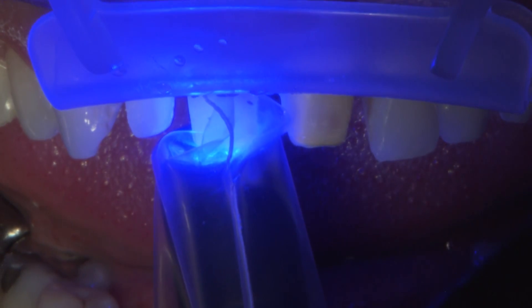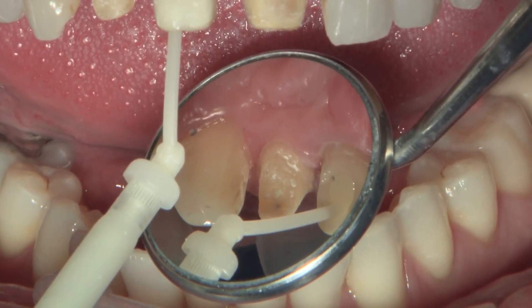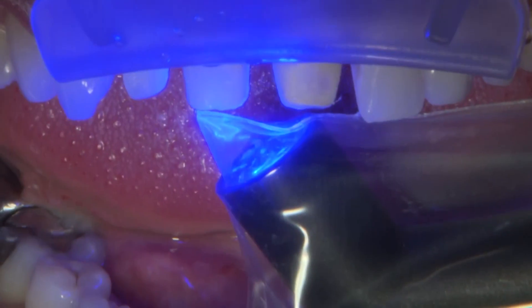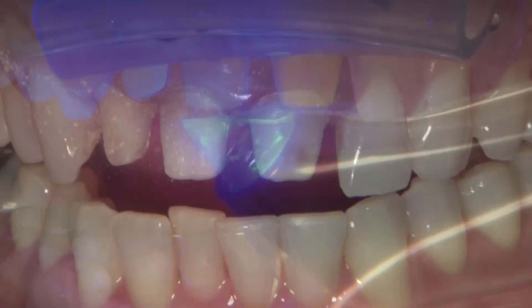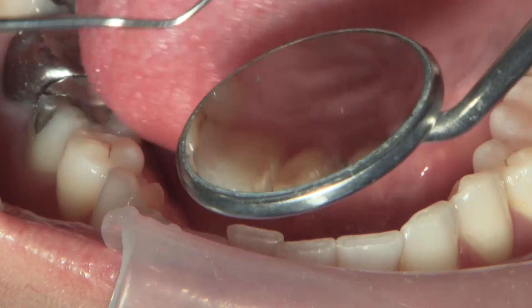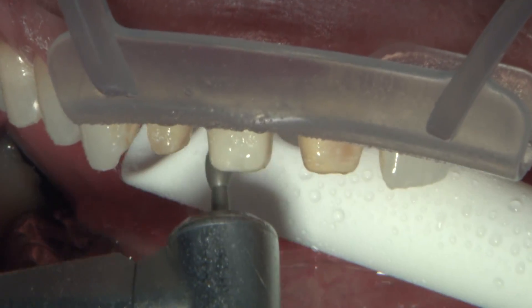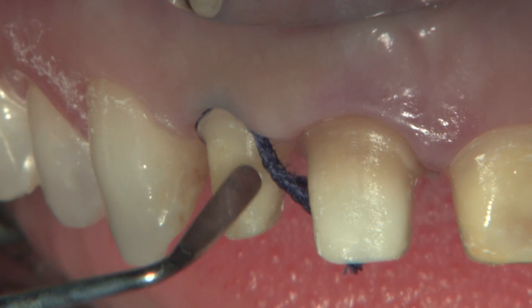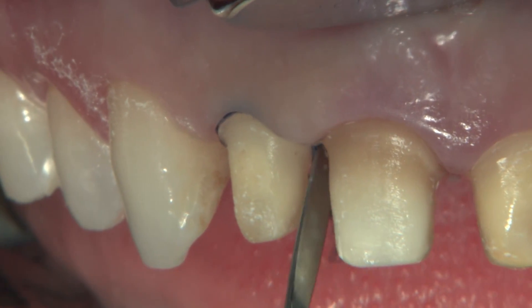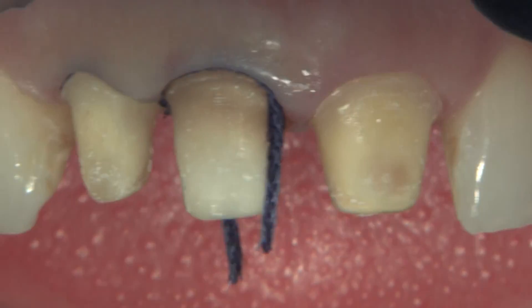Sometimes you don't know until you order the crowns, but that's why providing a prep shade or stump shade is always a nice idea. We like the Ivoclar shade guide — the natural dye material shade guide with the ST shade. Ivoclar sells dye material that completely matches that shade tab, so we're able to make dies out of it and try the Bruxer anterior crowns onto that die material to see whether it's going to show through — maybe at six-tenths or eight-tenths of a millimeter thickness. If there's an issue in the gingival third, we can call you and say this is showing through; the choice is usually going to be a less translucent material.